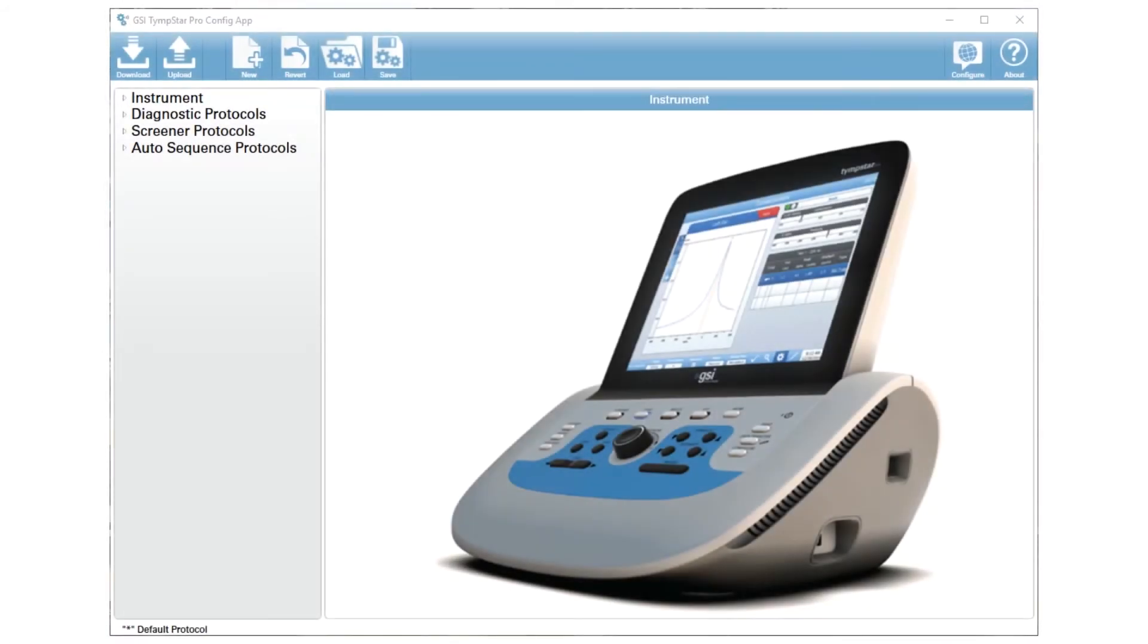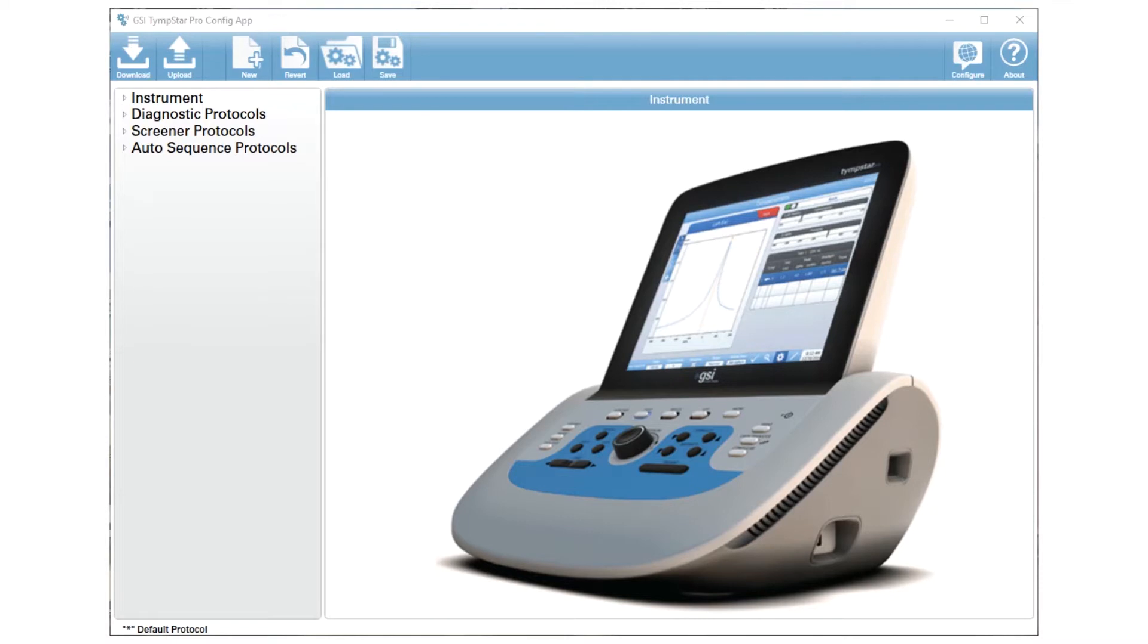One question that we get at Grayson Stadler is how do I change the start level of my reflexes, whether you're doing it manually or through the threshold seek. In order to change the start level of those reflexes, you will need to use your GSI TempStar Pro configuration application, a software program loaded on your PC.